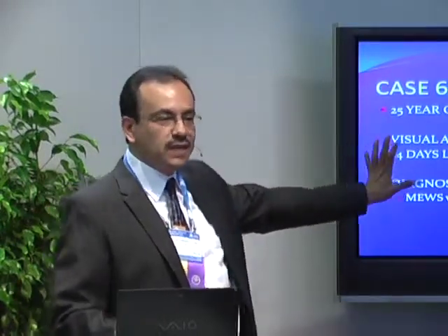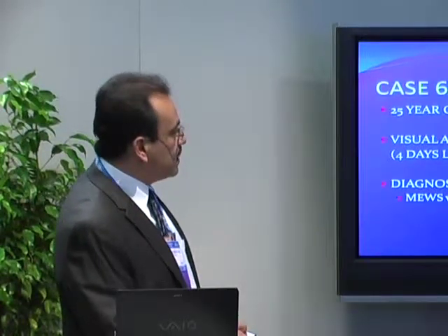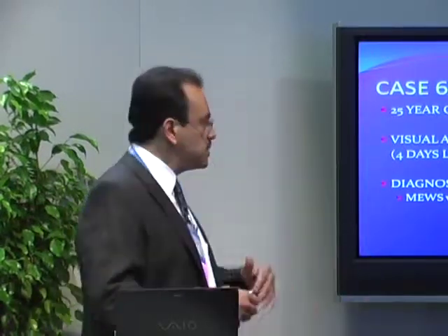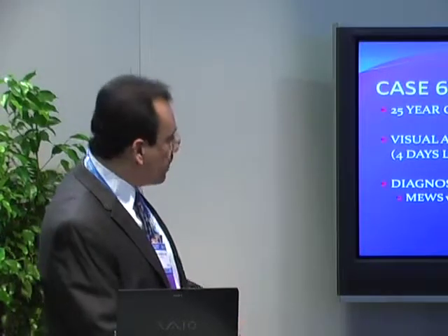This is a very interesting case that presented to one of my associates with non-specific complaints. "I woke up this morning and I just do not see right out of this left eye." And my associate took a history. There was really nothing there. There was nothing that he could see at the time. Maybe some non-specific changes in the choroid, but nothing else. No vitreous cell, no anterior segment cell. The other eye was normal. Four days later, the patient came back with a very important drop of vision.